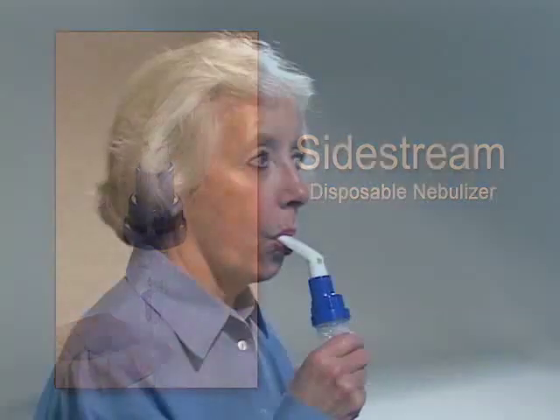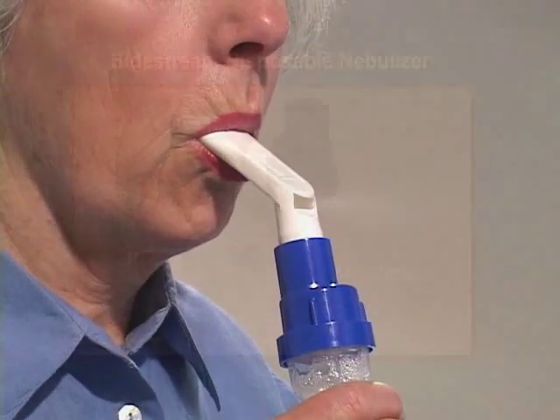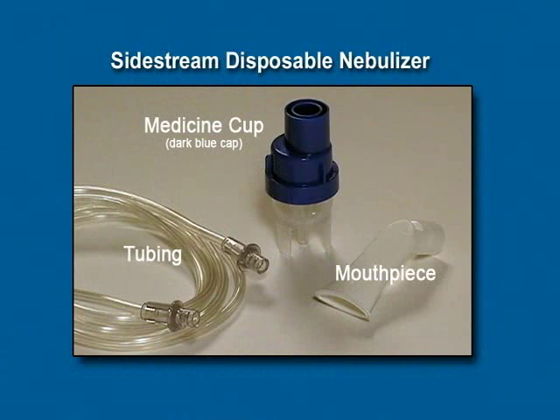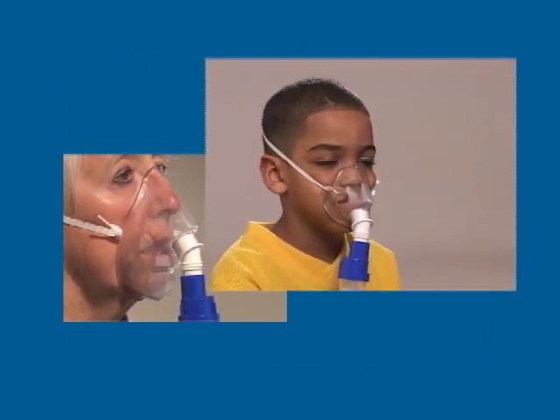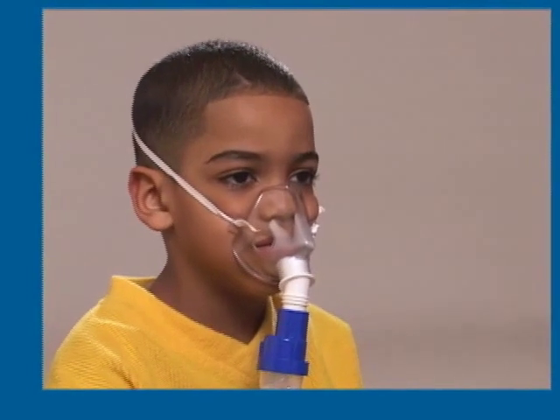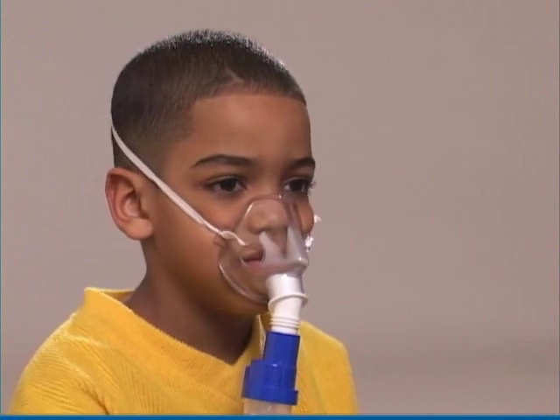The Sidestream Disposable Nebulizer uses air from the compressor to turn your medicine into a fine mist that you breathe. The parts of this nebulizer include a medicine cup with a dark blue cap, a mouthpiece, and tubing. Pediatric and adult masks are available separately and can be attached to the nebulizer in place of the mouthpiece. An adult should supervise the setup and operation of this compressor nebulizer system when being used by a child.